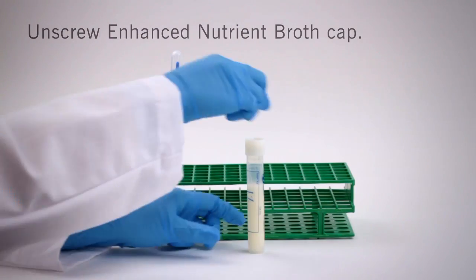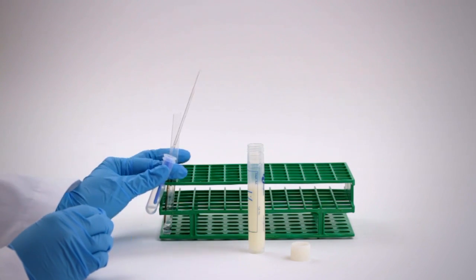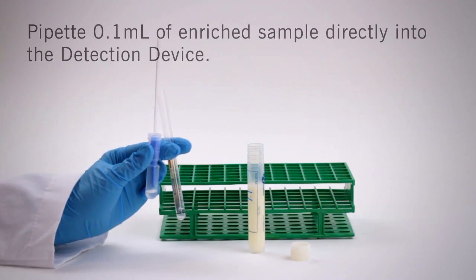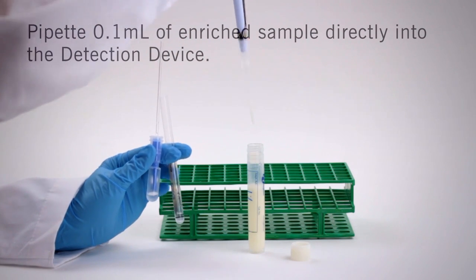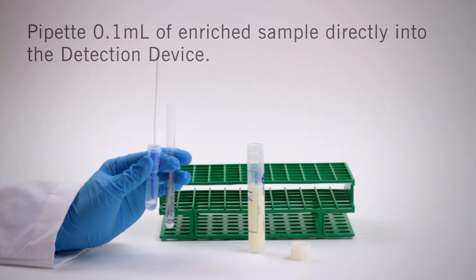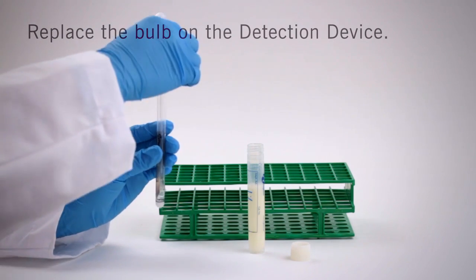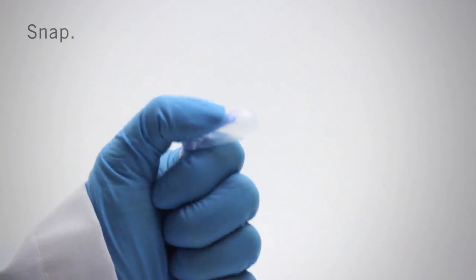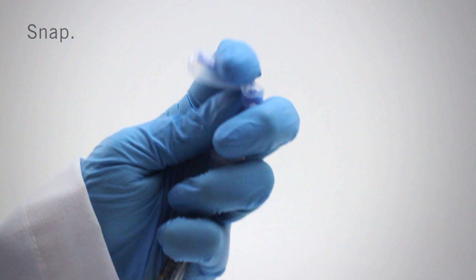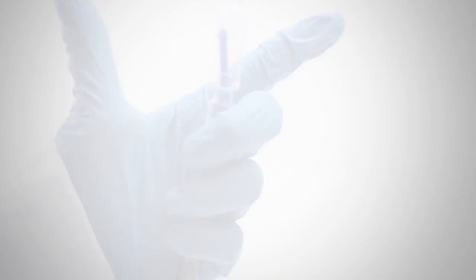Unscrew the Enhanced Nutrient Broth cap. With one hand, grab the detection device, and with your other hand, use a pipette to aseptically transfer 0.1 ml of enriched sample directly into the detection device tube. Replace the bulb on the coliform detection device. To activate Microsnap, hold the device in your fist and use the thumb and forefinger to break the snap valve by bending the bulb forward and backward. Then squeeze the bulb 3 times to release all liquid to the bottom of the tube, and shake for 5 seconds.